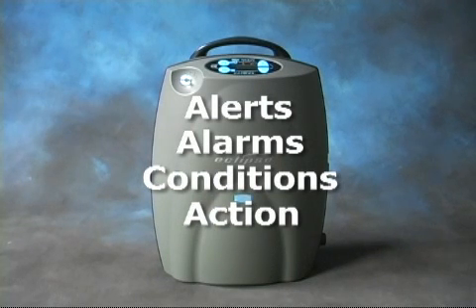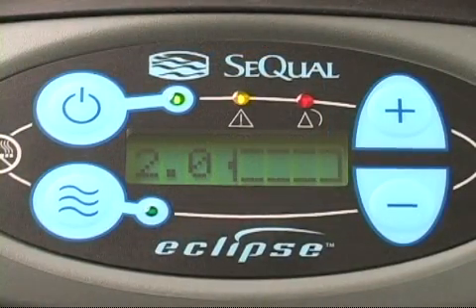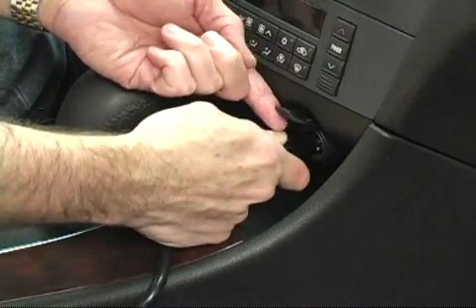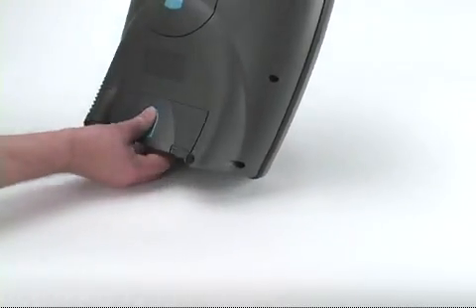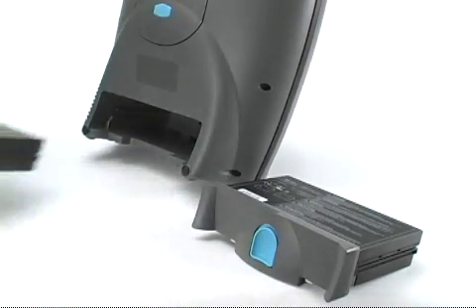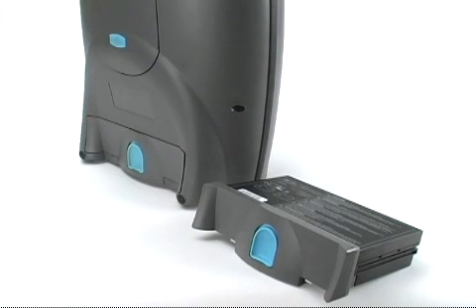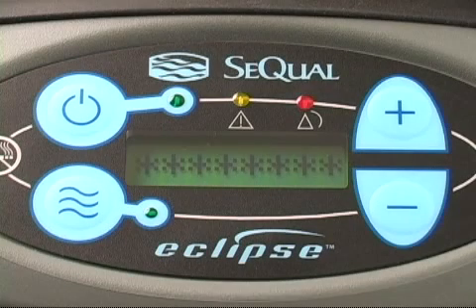In this video, we'll highlight a few of the more common alerts and alarms. If the power cartridge runs low or becomes too warm, an audible alarm will sound and the yellow indicator light will flash. You can remedy this condition by plugging your Eclipse II into an AC or DC power source or by replacing the power cartridge with a fully charged power cartridge. If the Eclipse II is not properly plugged into an external power cartridge, or if an overheating power cartridge is not replaced promptly, a shutdown condition could occur in which the red indicator light will flash and the audible alarm will sound steadily.